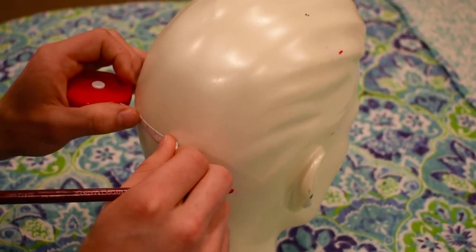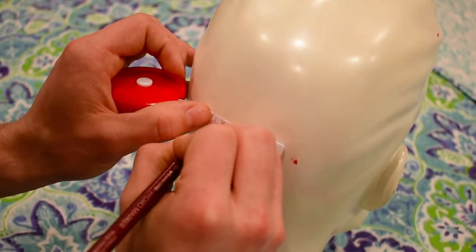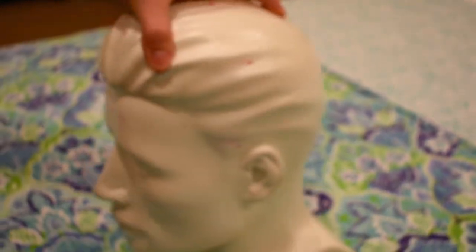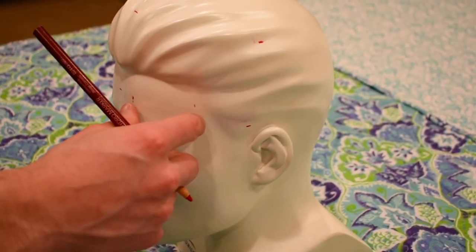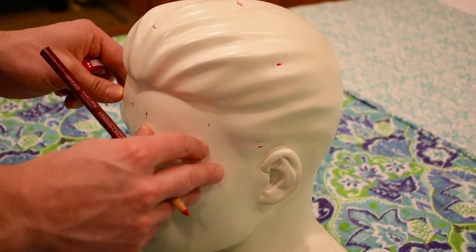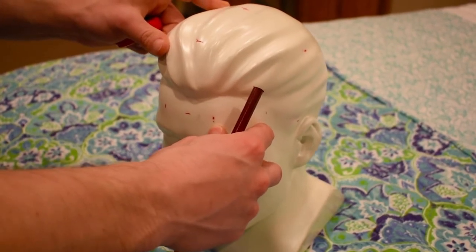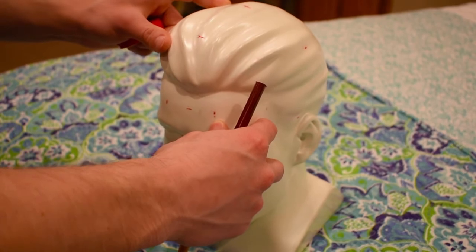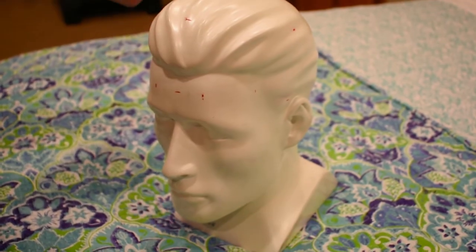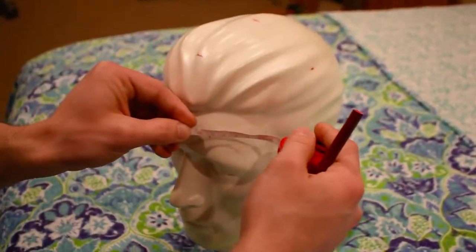And again for O1. And then the last thing that we're going to do with the circumference of the head is measure 10% more over from FP1 and FP2 to get markings for F7 and F8. So 10% to the left of FP1 is going to get us our marking for F7. 10% of that circumference of the head, which is again 55 centimeters, is 5.5 centimeters. So we're going to go ahead and do that.